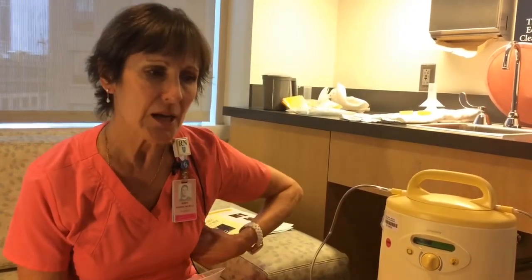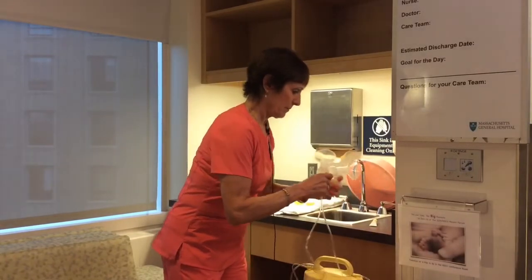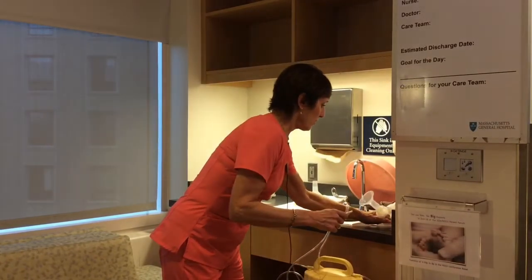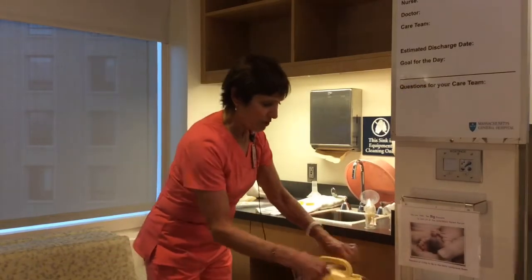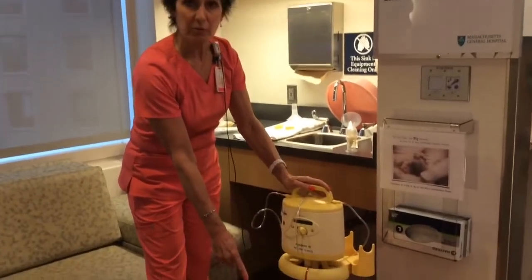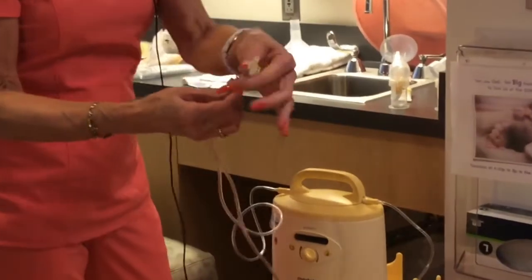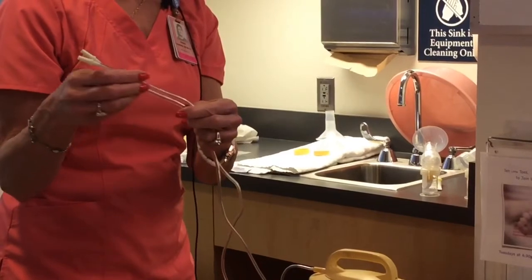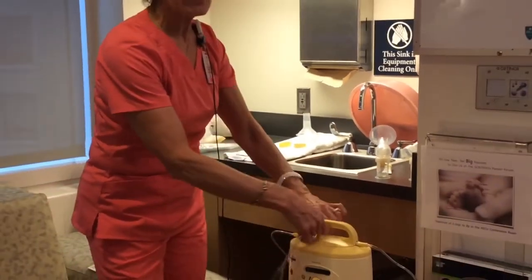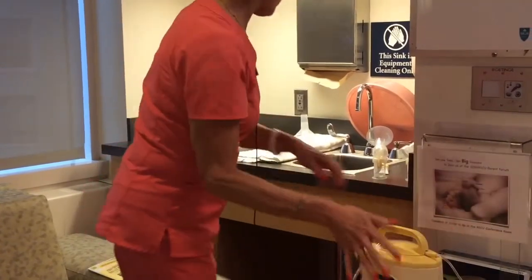You want to encourage mom to completely empty but she should not pump longer than thirty minutes. When mom's done pumping, you want to make sure she hooks the tubing through the top of the pump so it's not dragging on the dirty floor. She needs to turn the pump on high and blow air through the tubing. This tubing gets a lot of moisture, and if that moisture stays in there it will turn to mildew, so she needs to dry the tubing out. It takes one or two minutes while she's washing her pump parts — just let the tubing dry.